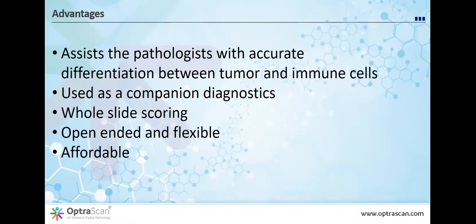That's already happening. There are studies being performed that show that image analysis in morphologic identification of tumor cells actually beats pathologists once it's been trained and then retrained against an ultimate diagnosis. So this is an iterative process. It's an ongoing process, and I've found it incredibly educational, both in terms of how good or bad I am at identifying cells and in fine-tuning the algorithm as you move forward. So that is a sort of a long-winded answer to a very difficult question. Are there other chat questions that we should deal with, Isha?